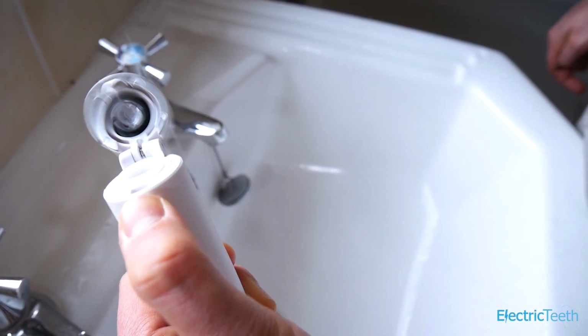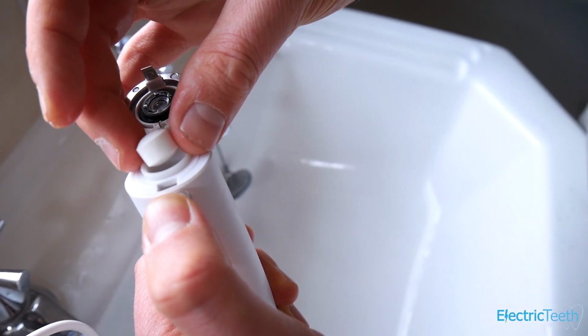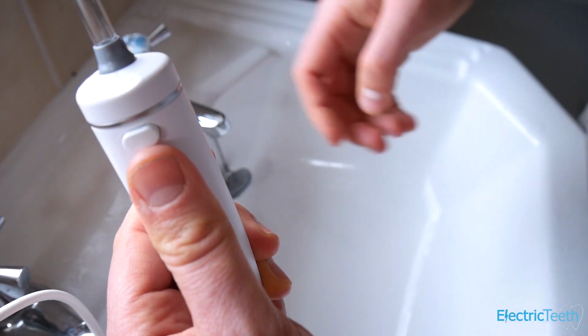Now, those tablets are designed to pop into the handle and they cost $10 a tub, which when you consider this to other water flossing products makes it a very expensive product ongoing. You can use it without the tablets and you don't necessarily need to use them, but they have silica in them, which is kind of like an abrasive agent, which is ultimately what is helping get rid of those external stains. As the water and the silica mixture is fired at the teeth, it's removing those external stains.